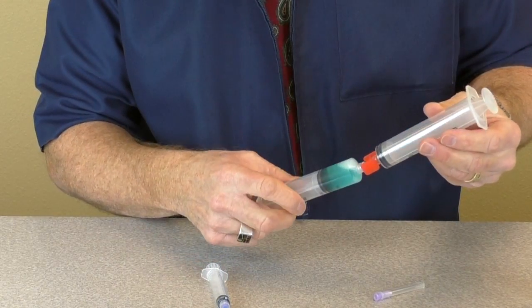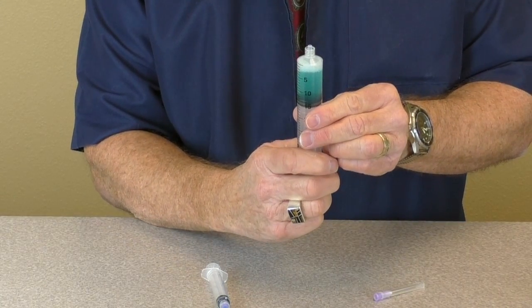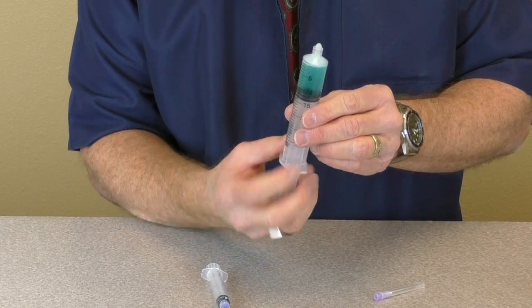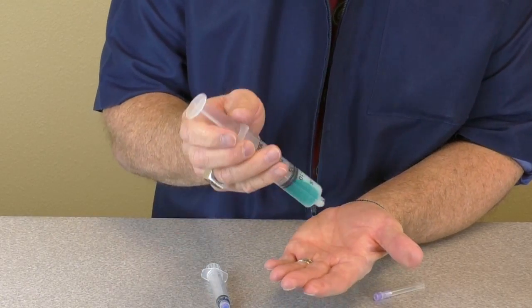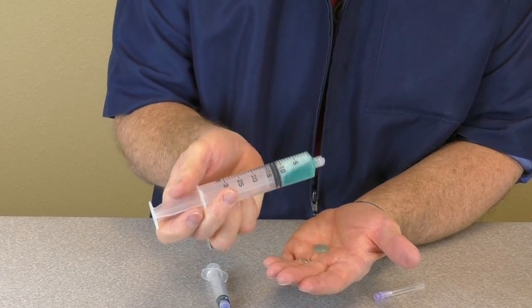Remove the empty syringe and transfer unit. You are now ready to apply this to the site of infection. Depending on the concentration, it takes about 15 to 20 seconds for this substance to jellify.